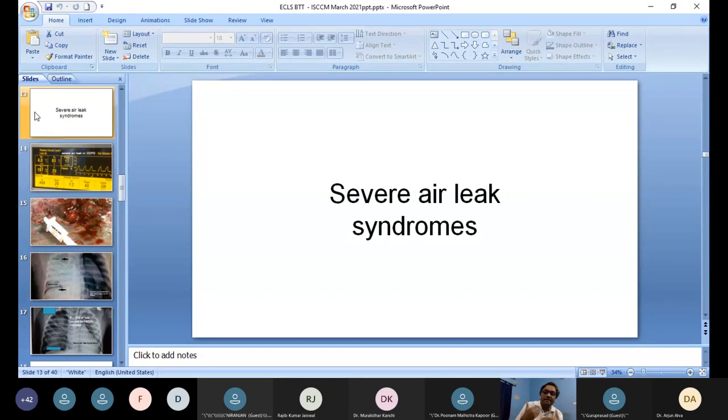It's called the Leto device. So you can either have active or passive. And this patient is on VV ECMO, but at the same time is undergoing physiotherapy. This helps build muscle mass. And this has been shown consistently to reduce the time spent on the ventilator, the need for tracheostomy, and the chronic weaning of patients post-lung transplant. So this is a very, very important aspect. Wherein you can do it if the patient is on ECMO.